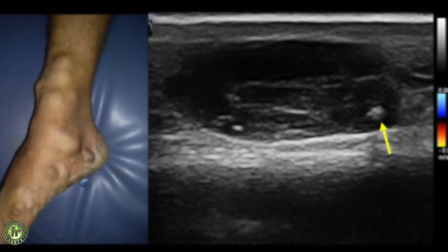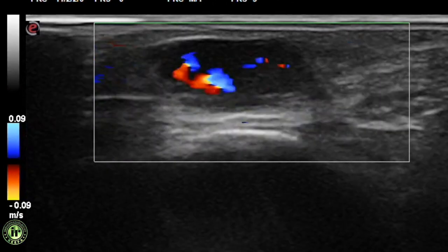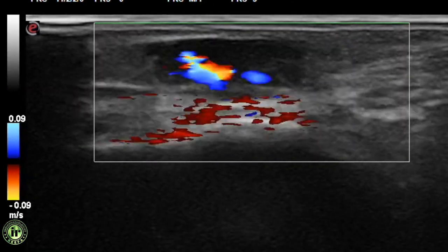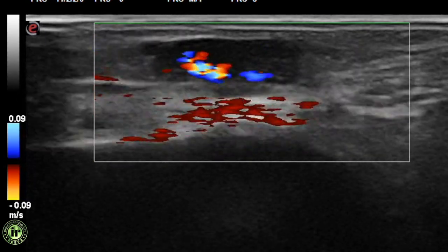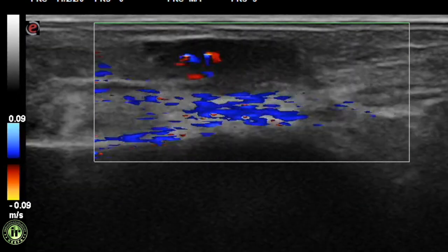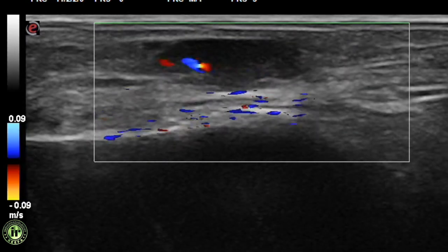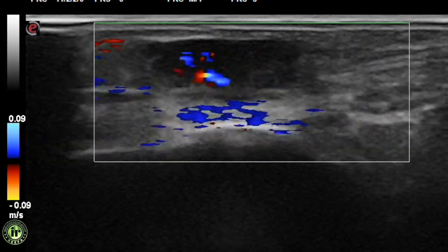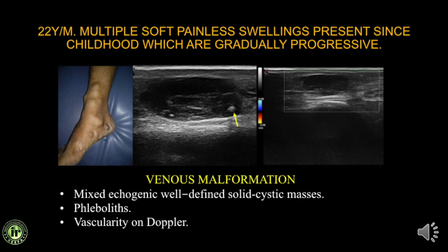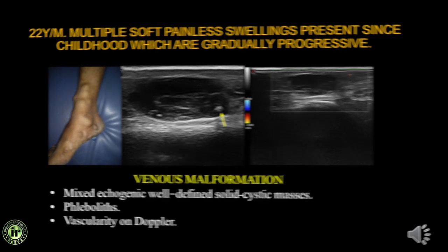A 22-year-old presented with multiple painless soft tissue swellings present since childhood that are gradually increasing in size. High resolution ultrasound showed anechoic channels with hyperechoic phleboliths within. The dynamic compression-release maneuver demonstrated retrograde filling of the channels. This was a venous malformation. The phleboliths and vascularity pattern were clearly demonstrated.